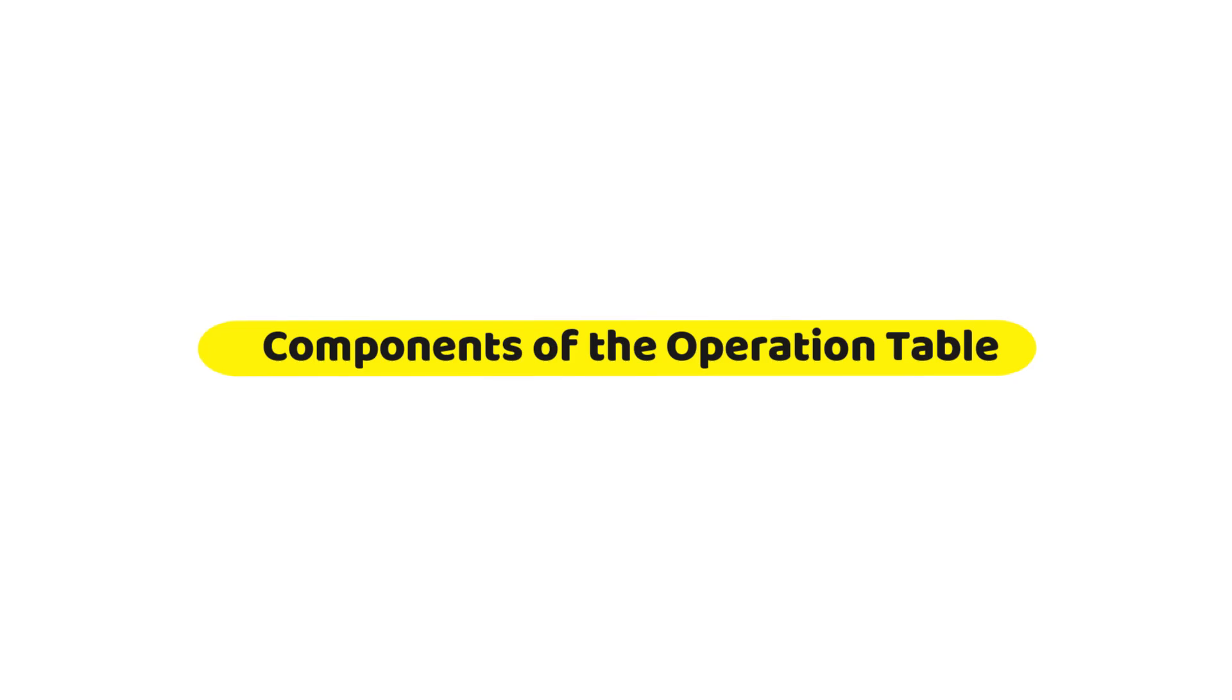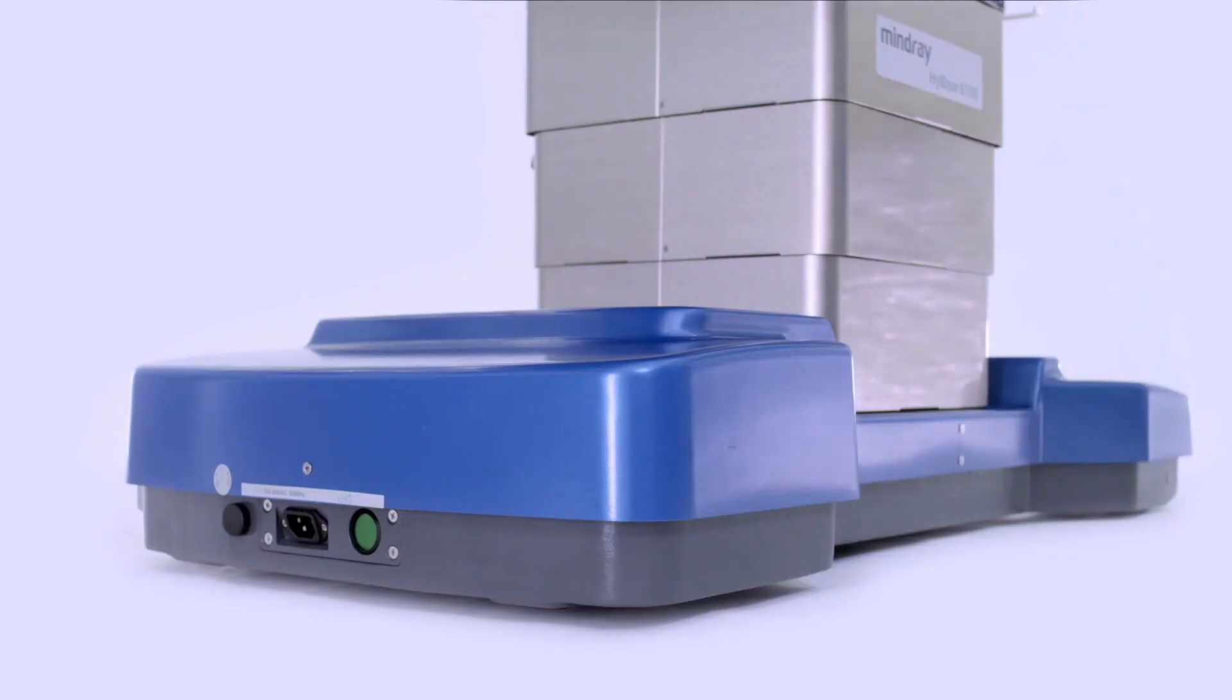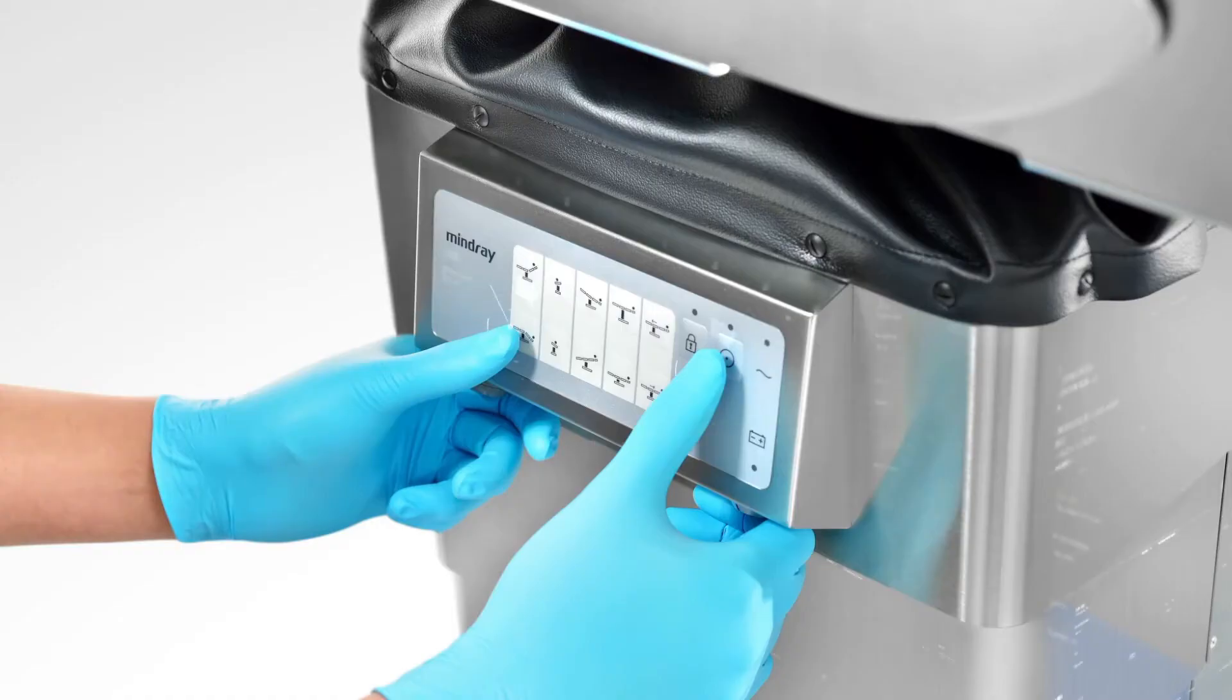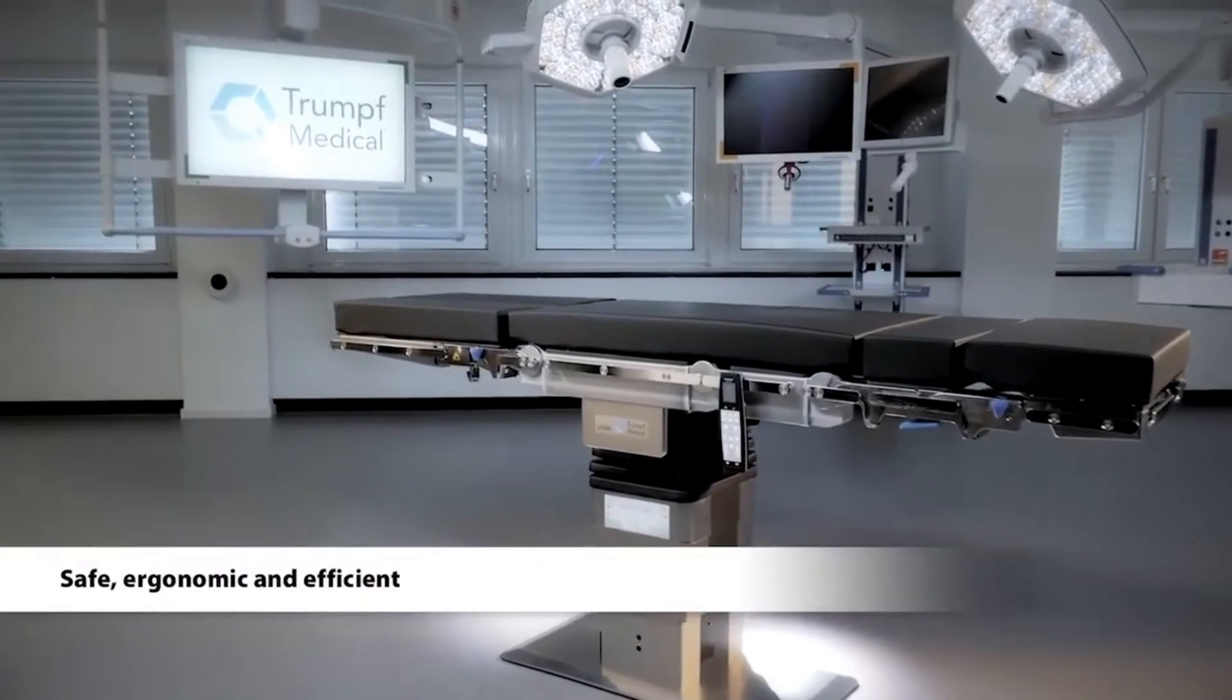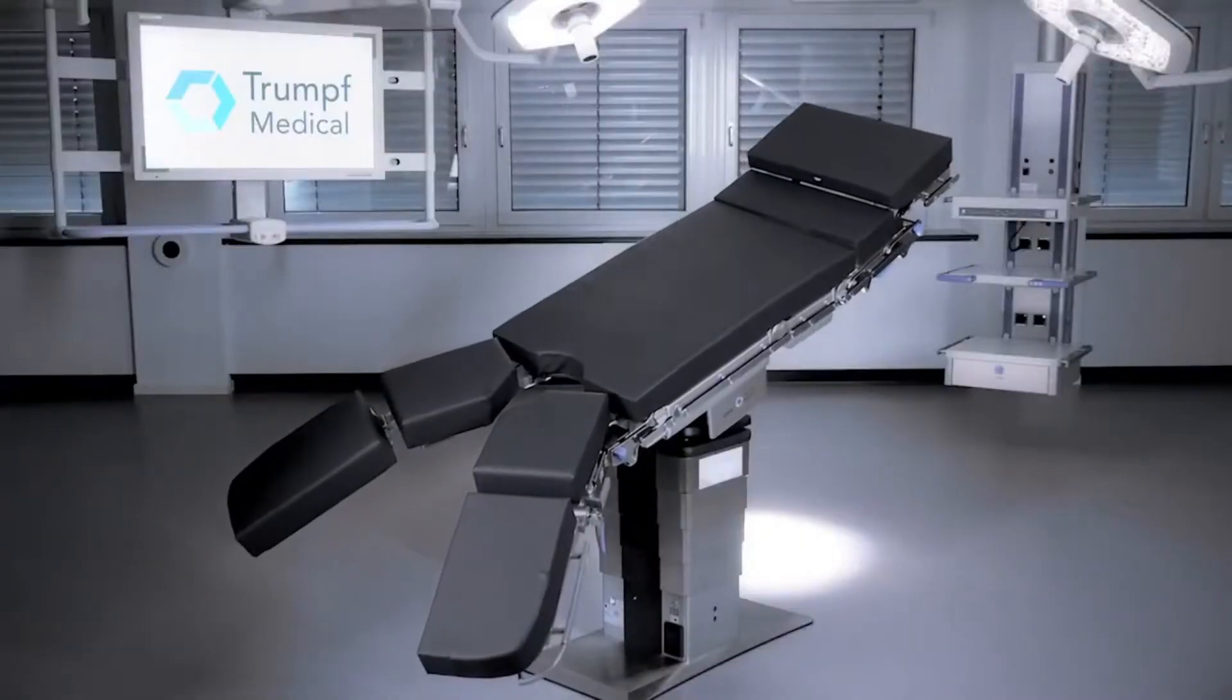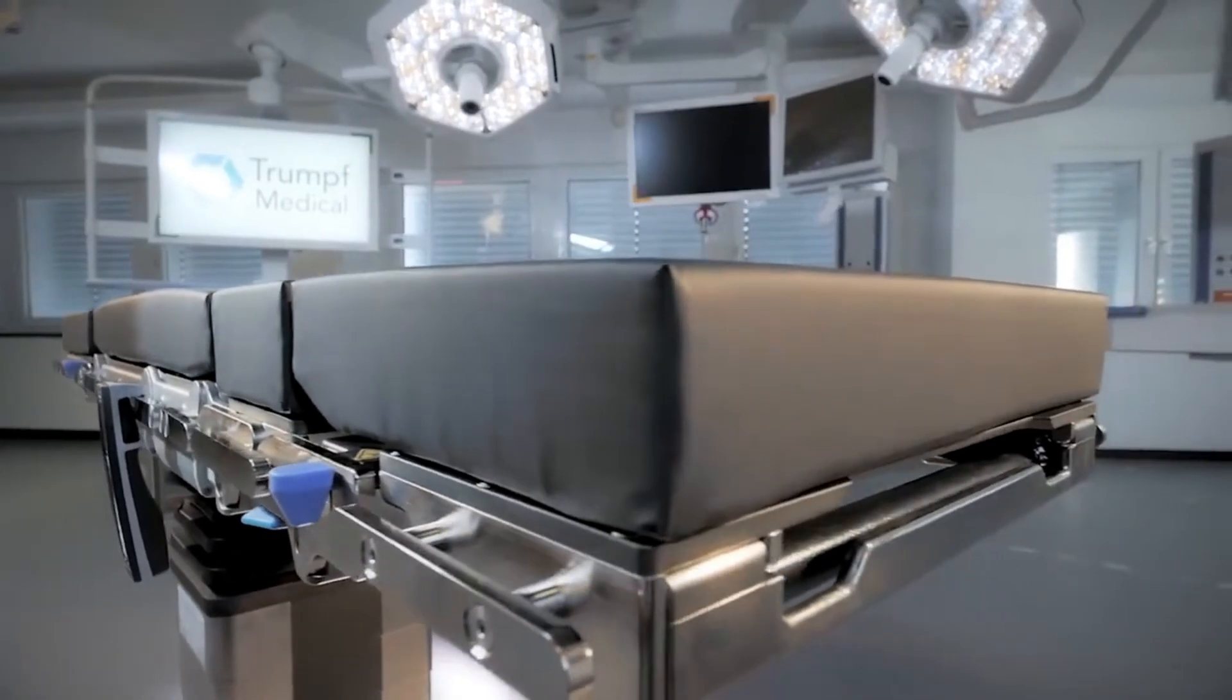An operating table consists of a radiolucent adjustable tabletop divided into sections for different body parts, a stable base and column for height adjustment and tilting mechanisms for body control (electric or hydraulic), a control unit for the surgeon, and various accessories.